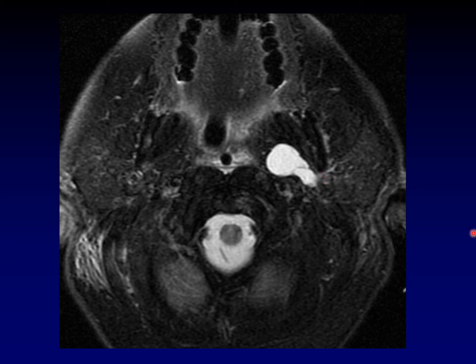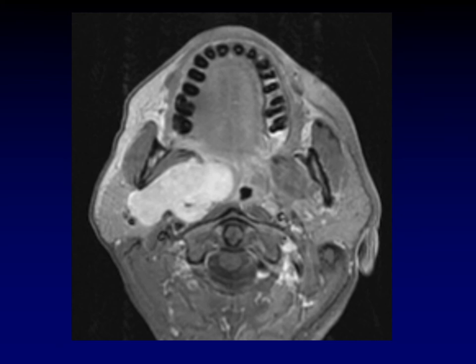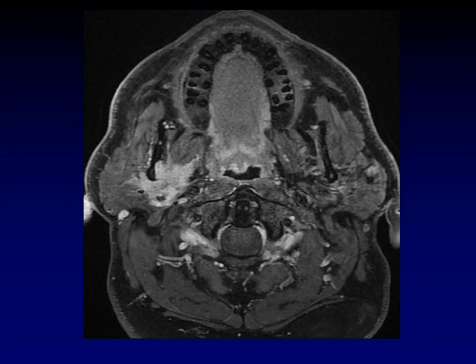This is a mass extending from the deep lobe through that stylomandibular tunnel. Here's another example where you don't even need to see the displacement of the parapharyngeal fat, because the relationship to the styloid — indenting the posterior surface of this uniformly enhancing mass — convinces you that this is a pre-styloid mass. It's another pleomorphic adenoma. Sadly, not everything in the pre-styloid space is benign. This happens to be an adenoid cystic carcinoma, which you can see displacing the parapharyngeal fat predominantly medially while also traveling along the mandibular nerve into the mandibular foramen. Adenoid cystic carcinoma is, of course, famous for perineural spread.